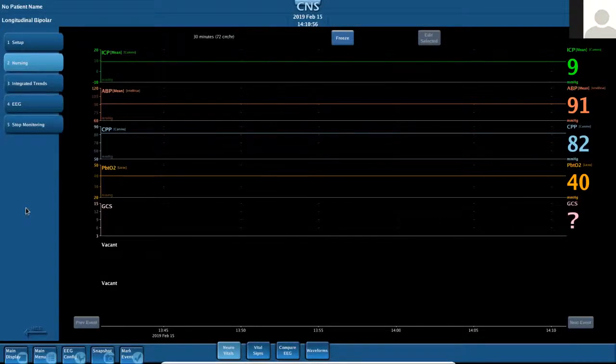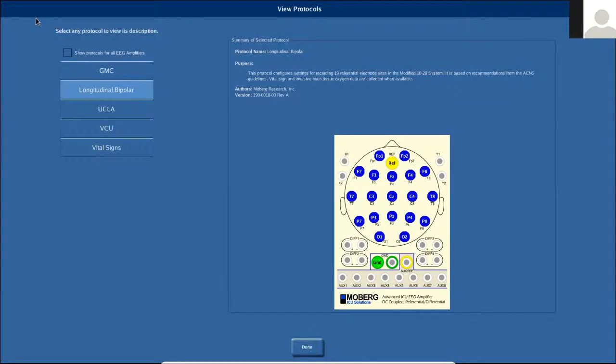Typically what we do before we come on site for training is we reach out to you and we ask you what devices you are interested in connecting to, and what particular measurements you want to get from that specific device. Then we build a template protocol for you, and you have that to use on your patients. But as time goes on, your protocols may change. You may get different patients, you may get different devices, you may decide to add things or take things away, and you may have the need to change your protocol.